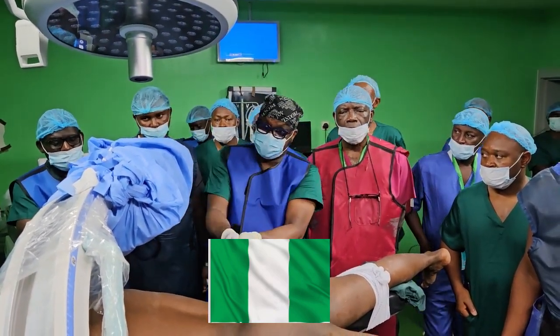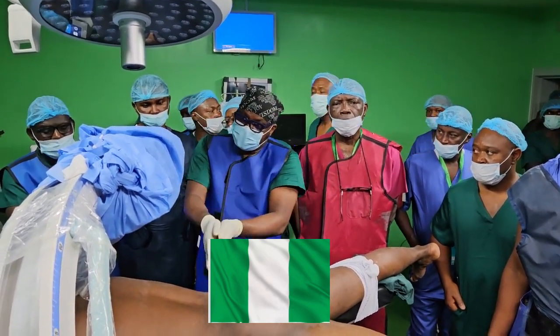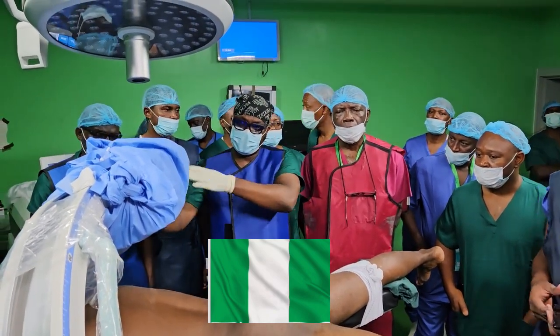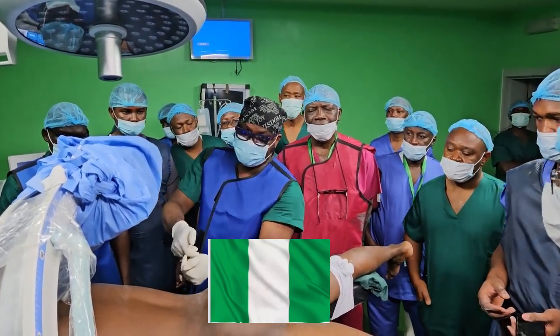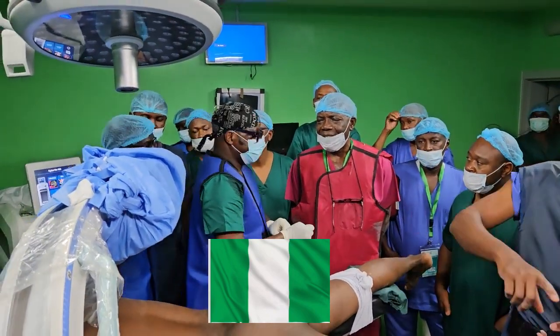You go and I will see whether I need to go deeper or more superficial, that's how we get it. There are different ways of doing it. It can be 30 degrees towards you like that, but I prefer this. So we can also do bullseye, then it appears. We'll see whether this can do it well.